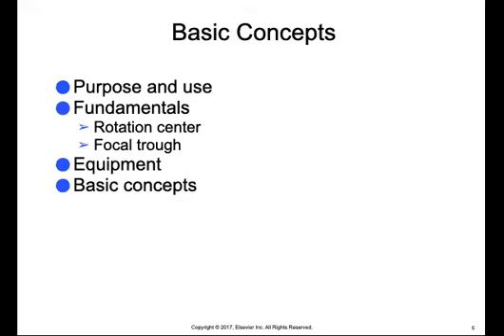Some basic concepts include the purpose and use of panoramic X-rays, the fundamentals, which include the rotation center and the focal trough, and the equipment that's necessary. A panoramic image shows a wide view of the maxilla and the mandible and surrounding structures.